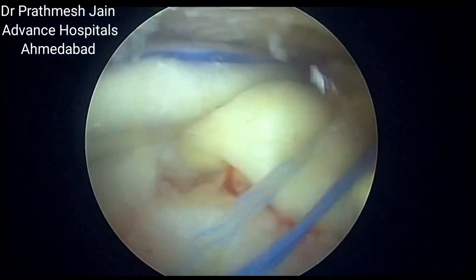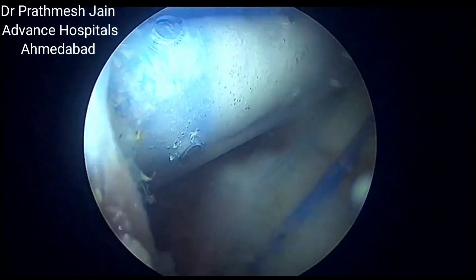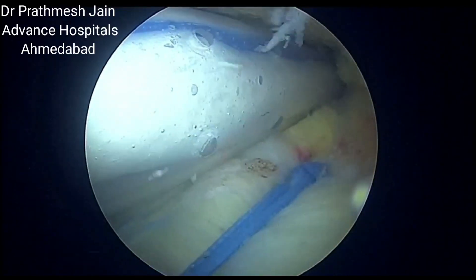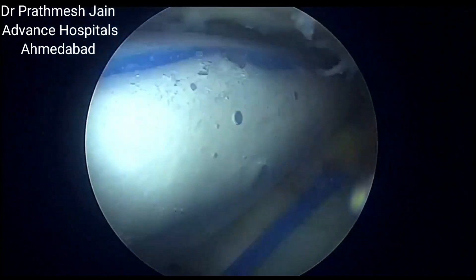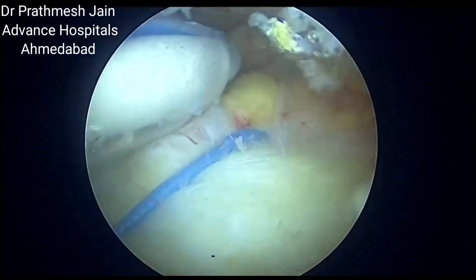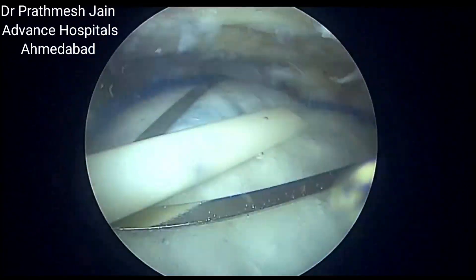Here, the Regenten large-size implant is deployed with the use of a deployer gun. The gun has a black trigger which, when pushed, will activate the gun, and then you press the trigger to deploy the graft into the rotator cuff region.